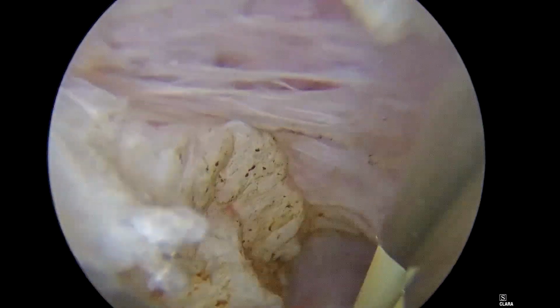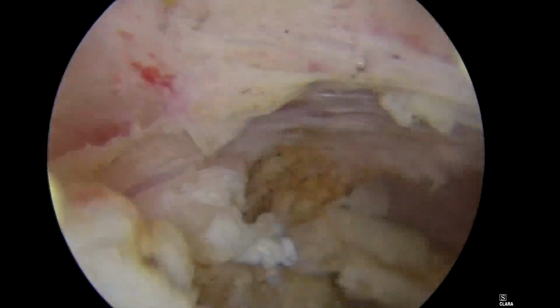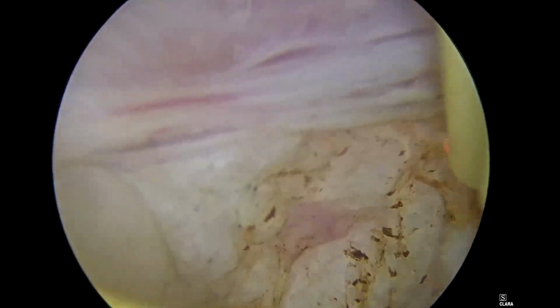This is very naive thinking, because high pressure will not push the fluid through an open vascular channel. On the contrary, it will compress, tamponade, and close the blood vessels. Here I was operating outside of my comfort zone, using a standard pump, which does not provide higher pressure.